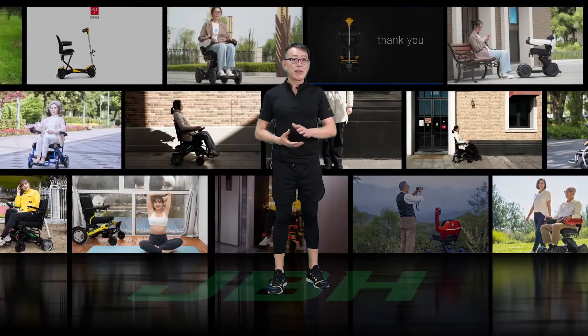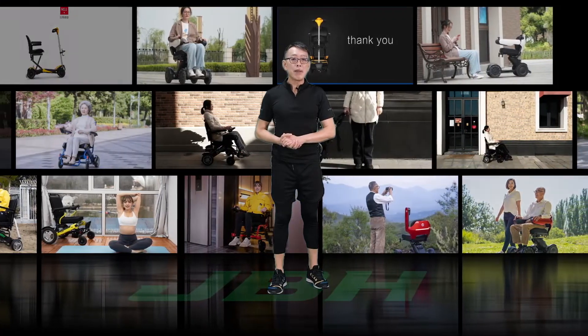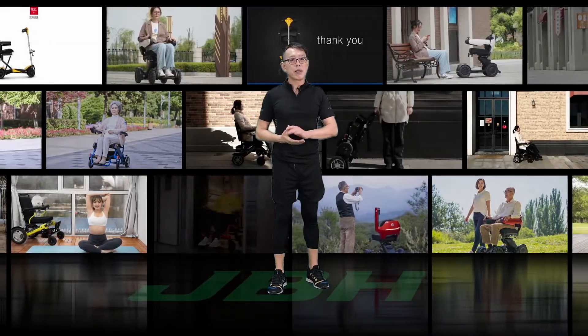This wheelchair today is very special — it's carbon fiber, so it's much easier to handle because of the lightweight.